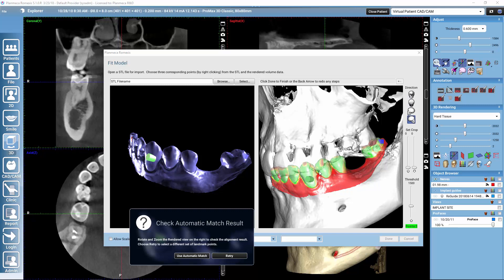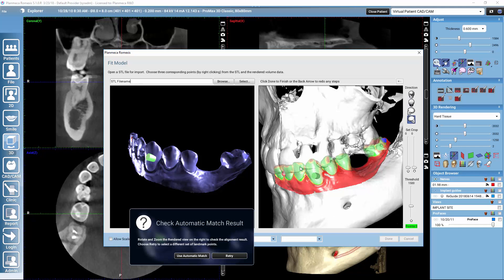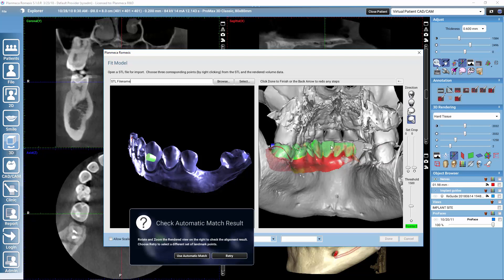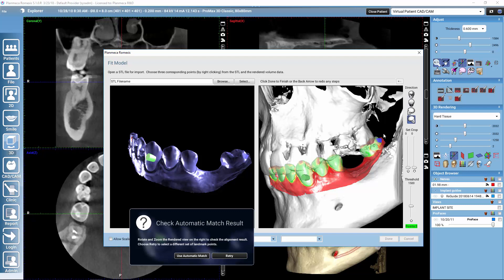Any objects visible on both images should be green, and those not visible on both images should be red. My match looks quite good. We notice some red spots, but that is totally normal because the CBCT is never as exact as an intraoral scan — there might be distortions in shape, and having the jaw closed can also give some distortion to the cusps of the anterior teeth. What is important to check is that overall the color of the crowns is green. If the molar were red, for example, that would mean the model is tilted towards the anterior, and I should check my three points.